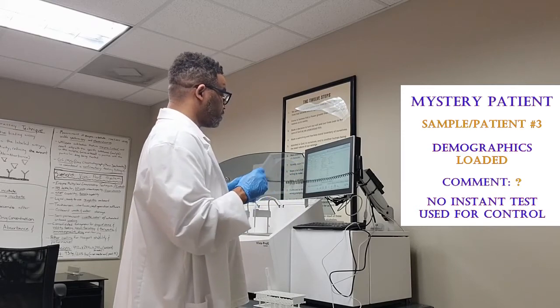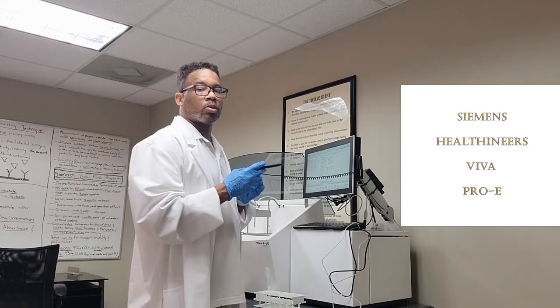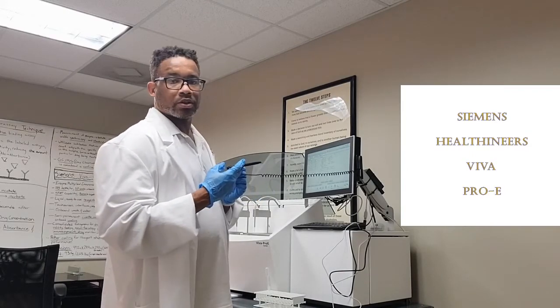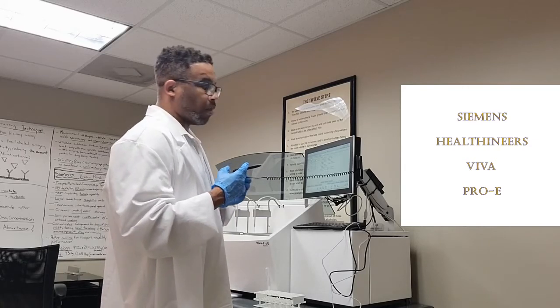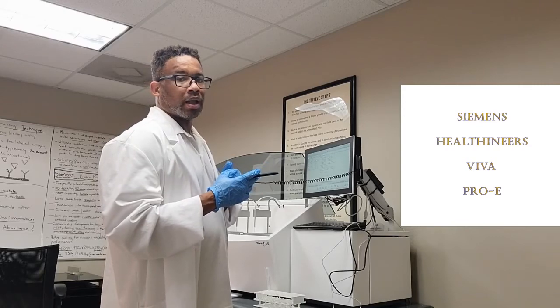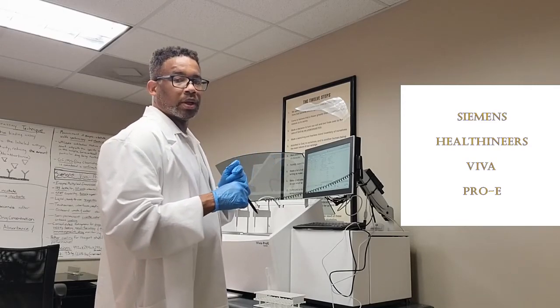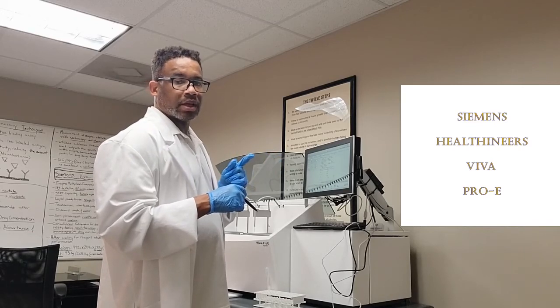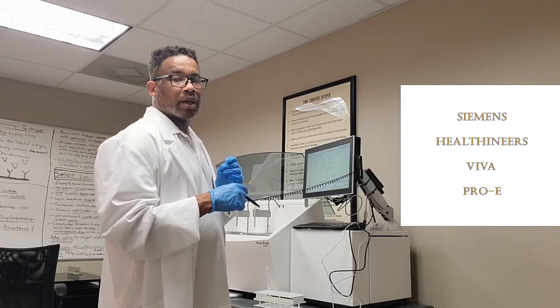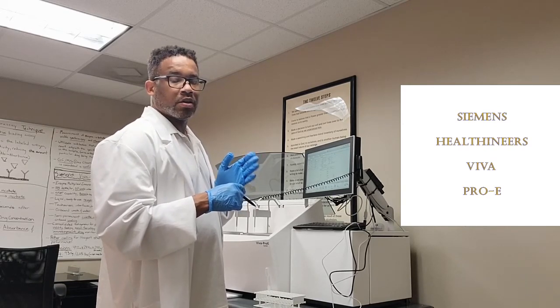So this experiment went pretty well. We see that the machine is working properly, our controls are working, our calibrations are correct, and throughout the next couple of weeks, we'll be doing mock experiments to make sure that this machine is working properly, and our technique for testing is going according to plan, and we're getting balanced samples. Creatinine levels are good, there's no dilutions, and patients are being accurately assessed for their drug levels.